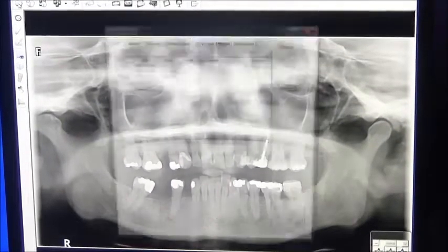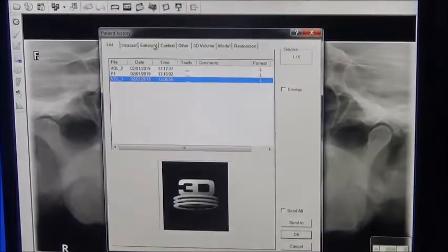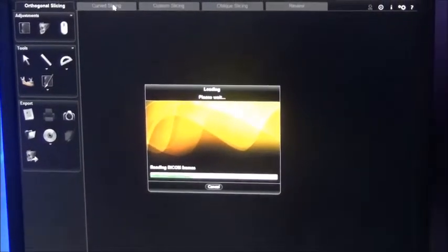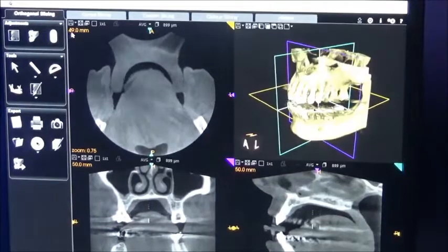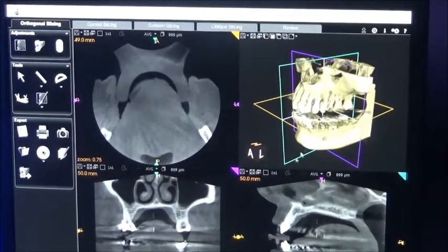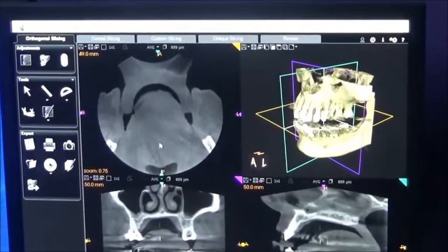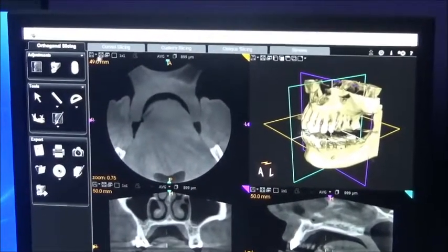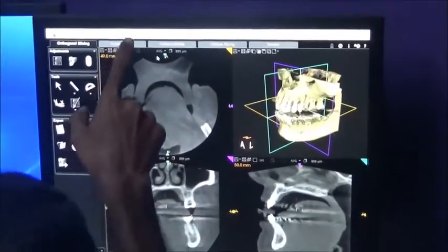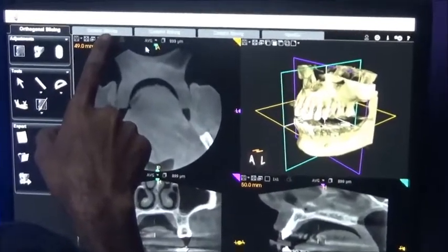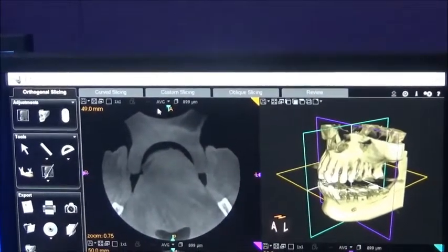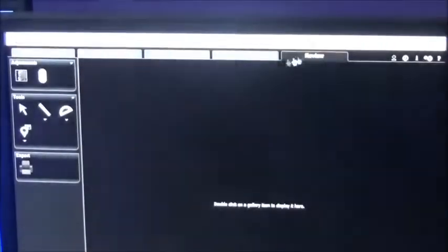Now I will tell you how to open the CBCT. Volume one means it was taken first; volume two means it was taken second in chronological order. So you will be getting initially these four boxes. Here you can see: curved slicing, custom slicing, oblique slicing, review. So there are three slicings and one review.